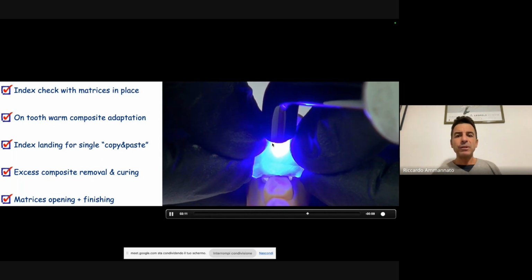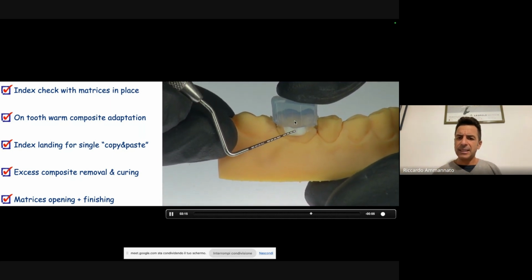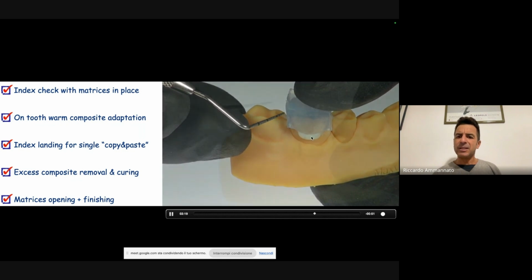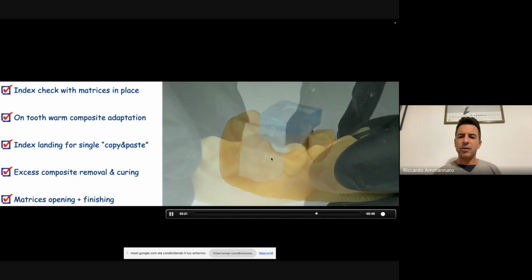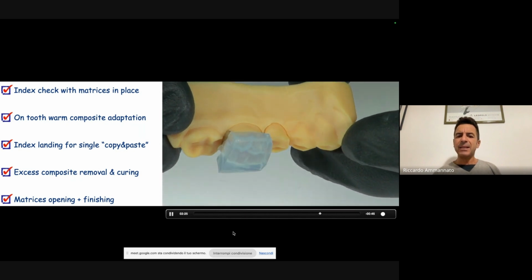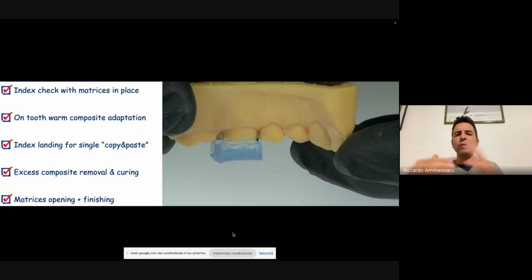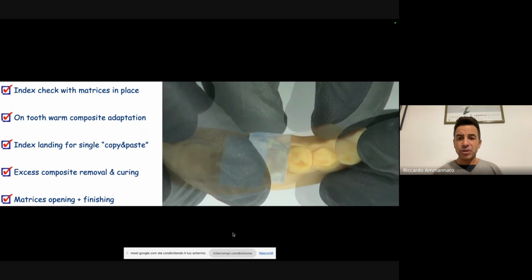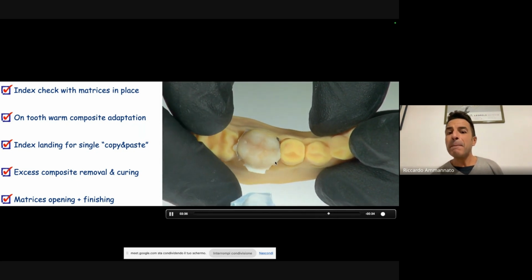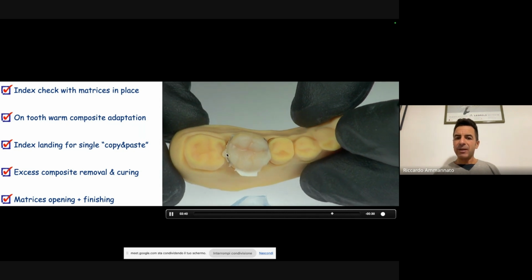And here we're curing through the index, and we'll see clinical cases later on. And you see here that it's precisely landed there. The key is kissing the flow line, the stop reference. So now I'm going to remove my key that you see there. And after removing my key, I will do my finishing procedure. But what I wanted to share with you is the fact that we really have minimal excess material here. I have a little bit more.